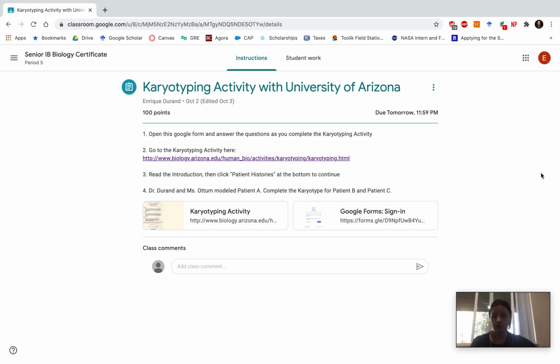We noticed one or two students are having a hard time completing the karyotyping activity, so I'm making this video to show students how to complete patient A and the poll. So the first thing you're going to do is go to Google Classroom. I'm going to be going a little bit quickly, so it's brief, but feel free to stop the video or pause it at any point.